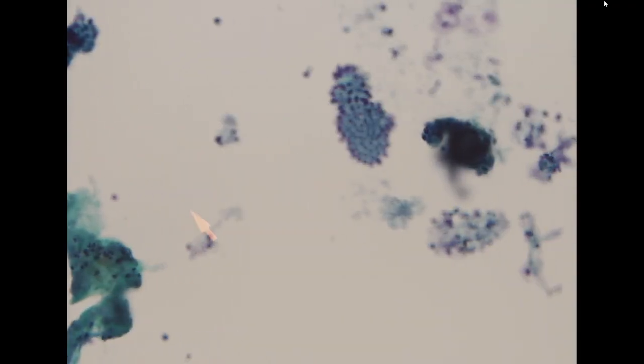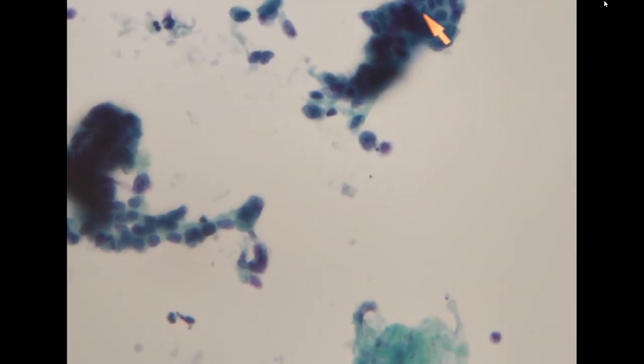So in this specimen, compared to these normal mucosa, we can see very tight three-dimensional clusters with more hyperchromatic nuclei. It is a little bit difficult to see through if it is very three-dimensional, but if you take a look at the single cells at the periphery, you see high NC ratio, enlarged nucleus, nucleolus, and hyperchromasia.